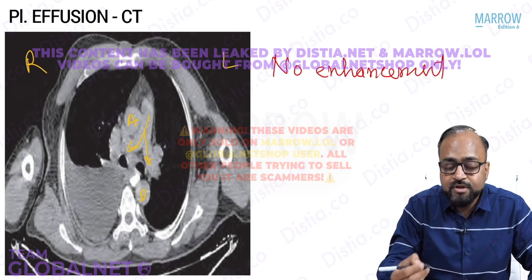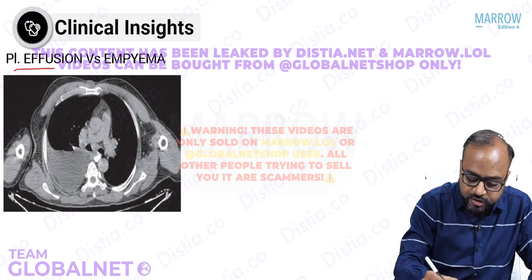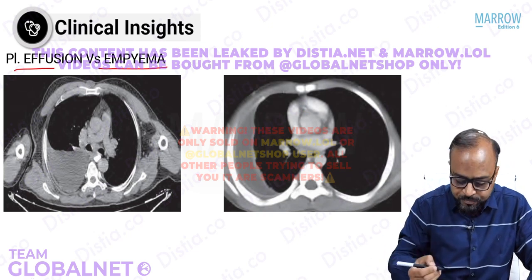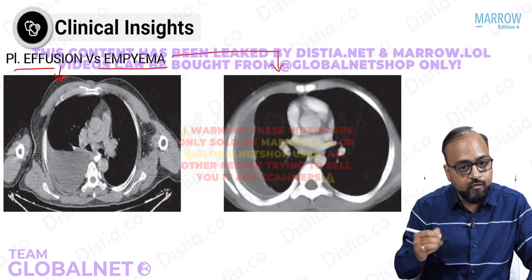When pleural fluid gets infected, it no longer remains pleural effusion. It is called empyema, and an empyema usually shows enhancement. Can you see the difference here between pleural effusion here and empyema here? What is the difference?